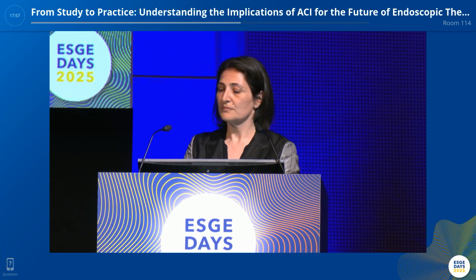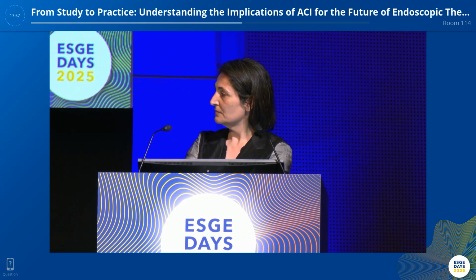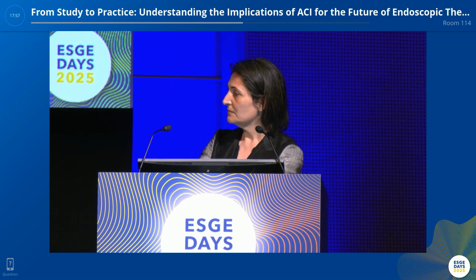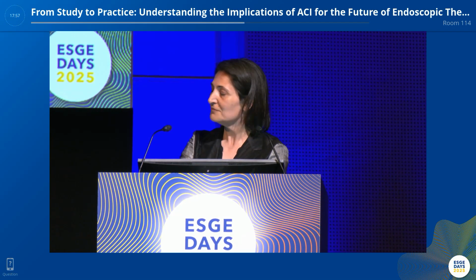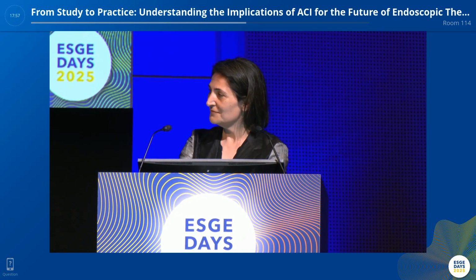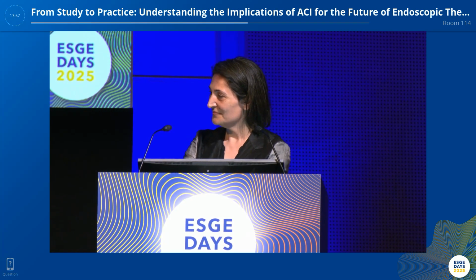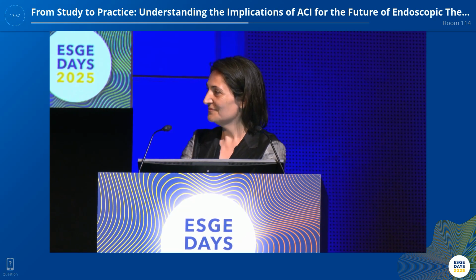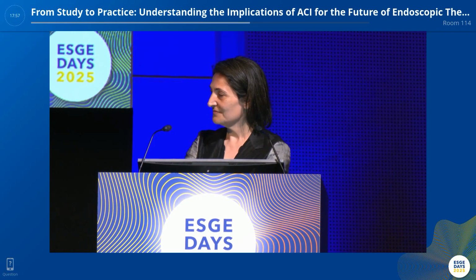One more point comes to my mind based on what Professor Yahagi said, then Ed said, you said. Looks like ACI is a submucosal endoscopy mode. So although Fuji started with creating a mode to recognize vessel and bleed control, suddenly we have found a completely new use for it in submucosal endoscopy to identify where muscle is, where submucosa is.